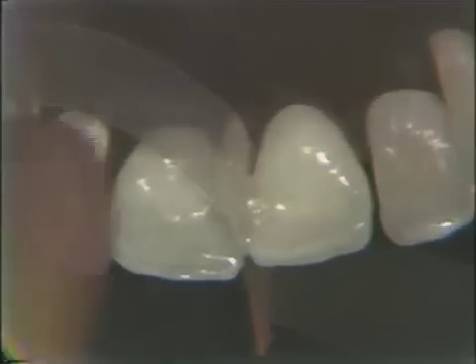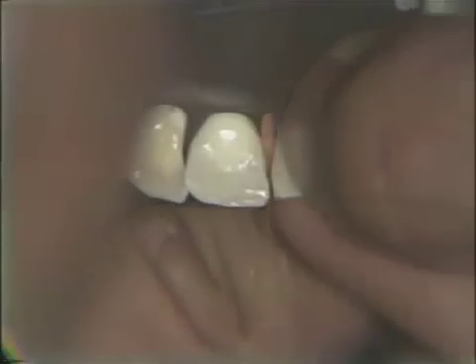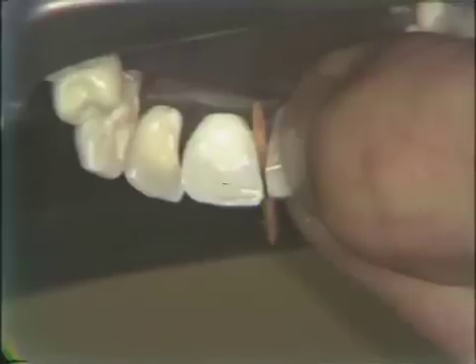Then you saw the Teflon instrument come in and wipe off the excess. And if you notice now, the thumb is placed over the lingual opening, and it is pulled to the labial, and the wedge is placed in with pressure.